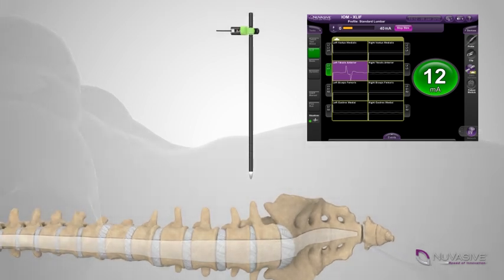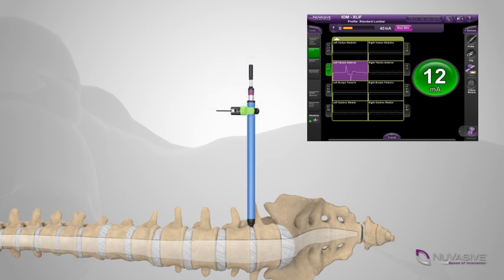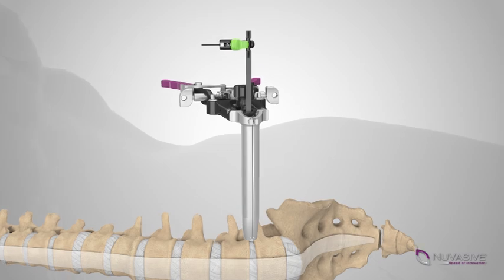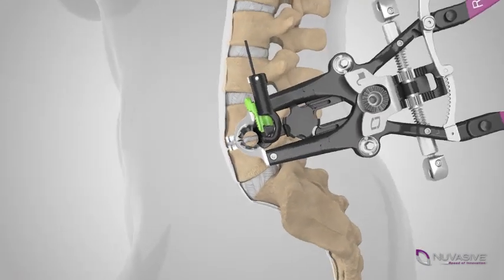Dilators will be used to direct the path to the affected disc space, while advanced monitoring will help the surgeon avoid local nerves. Once the safest path has been determined, a retractor will be utilized to hold the skin incision open, providing access and visibility to the affected area.